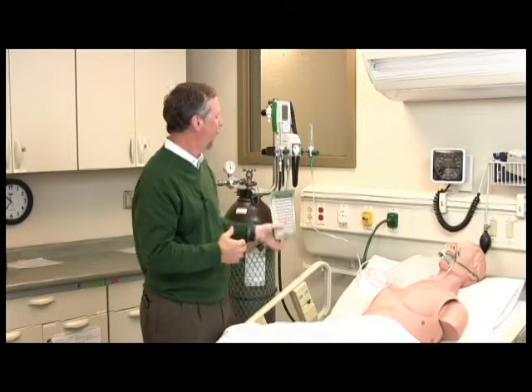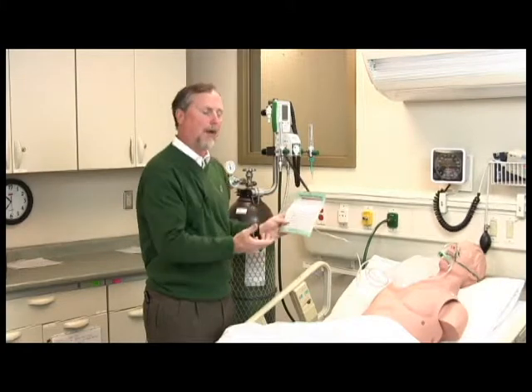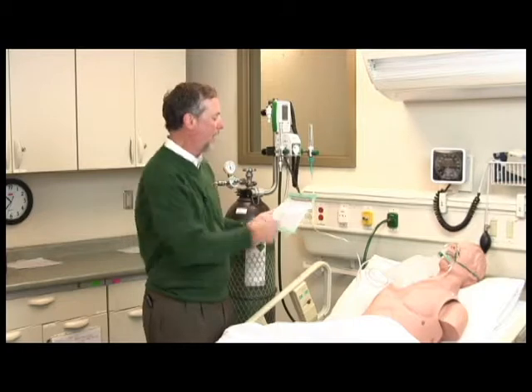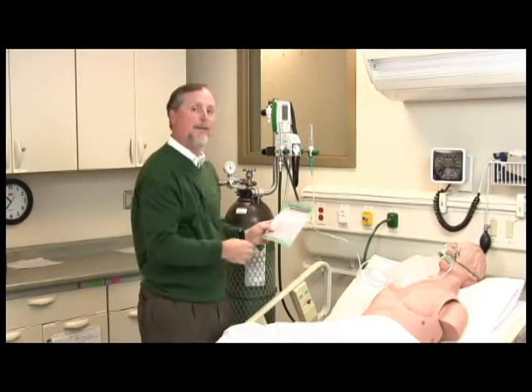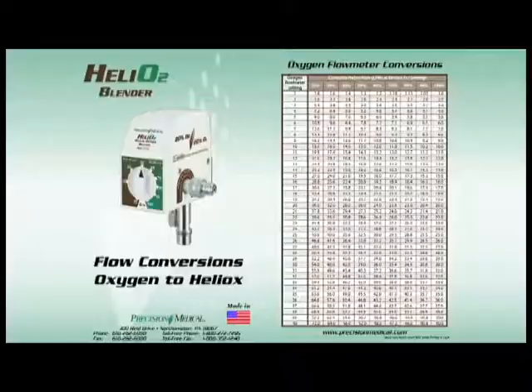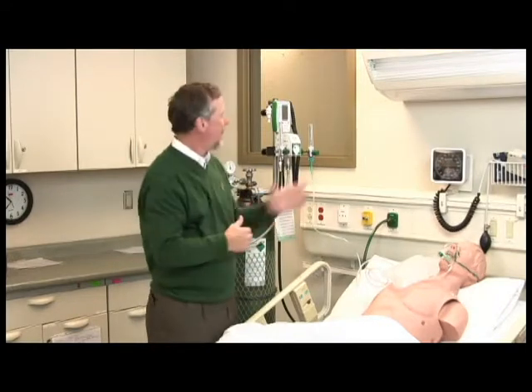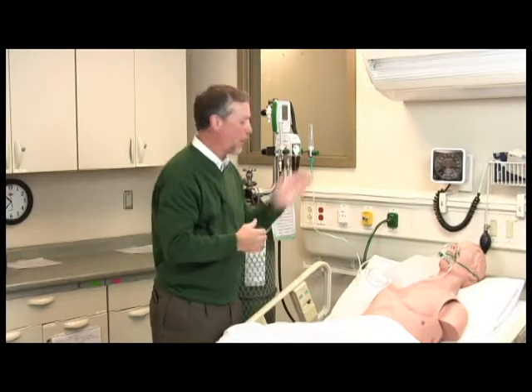But with this, what we have done is we've given you well-published conversion factors for helium and using oxygen flow meters, and basically you reference what FiO2 you're at, reference the card. You can either set your flow meter and see what your total flow is, or if you're doing a form of therapy that requires you deliver a total flow to the patient, you can find that total flow in the chart and then find the corresponding liter flow on the Thorpe tube flow meter. So in this case, we're at about 20 liters per minute at 40% oxygen.